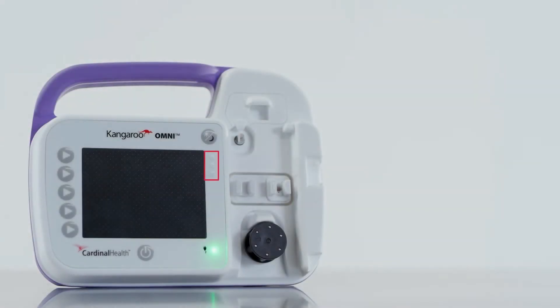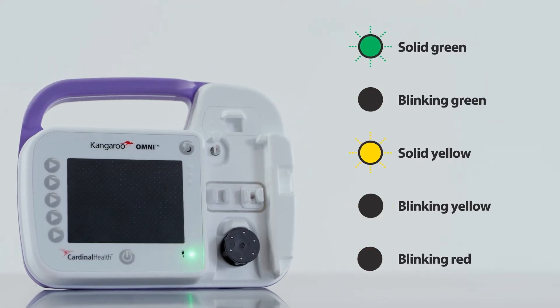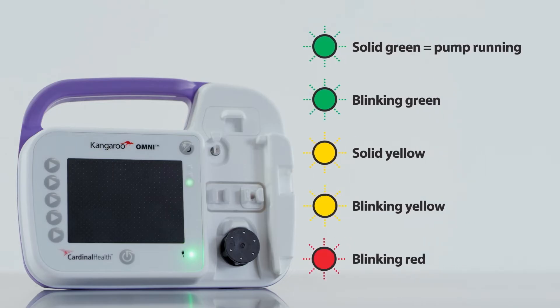In the upper right corner of the Kangaroo Omni enteral feeding pump, the pump status indicators are LED lights that provide a quick visual indication of the pump status. There are five different light patterns. First, a solid green light means the pump is running normally. Second, a blinking green light indicates the pump is ready to provide nutrition. Third, a solid yellow light is a low priority alarm — the pump is still running normally, but it will need the user to take action soon or else it will stop functioning properly.